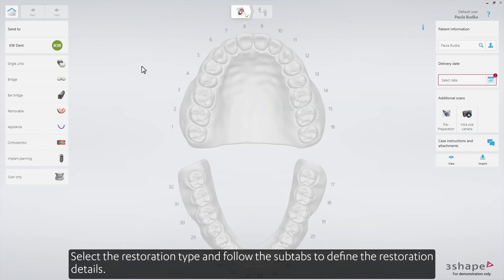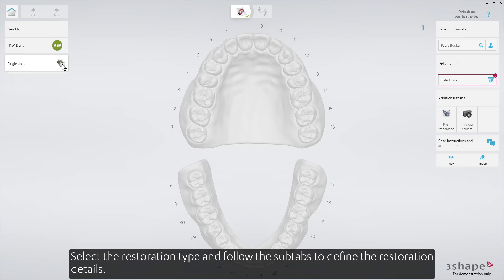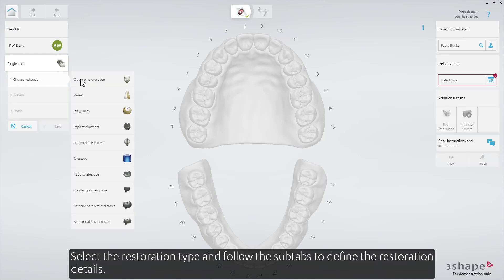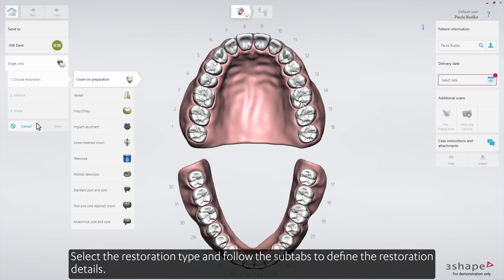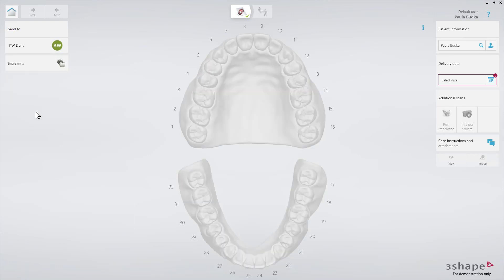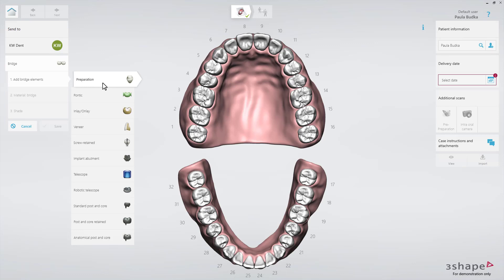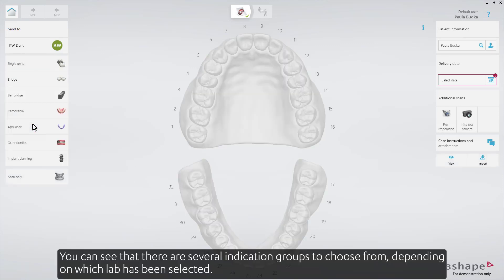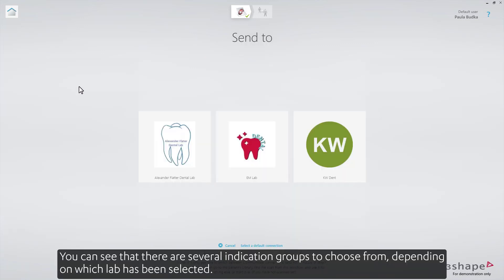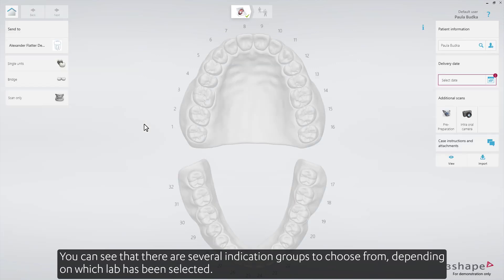Select the restoration type and follow the sub-tabs to define the restoration details. You can see that there are several indication groups to choose from, depending on which lab has been selected.